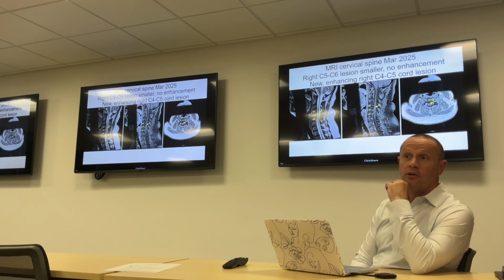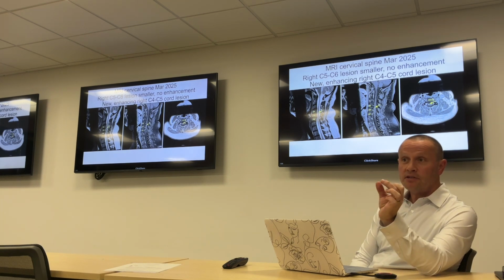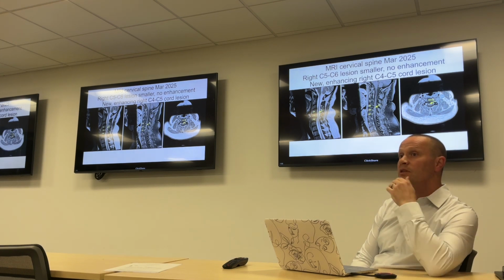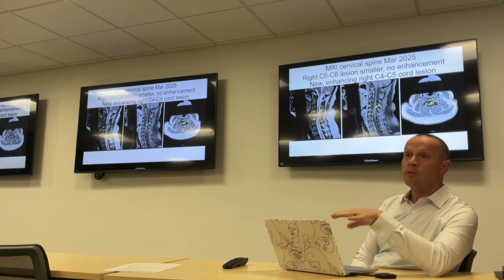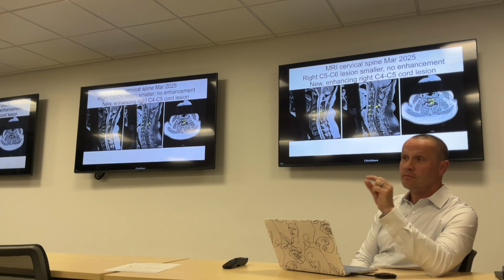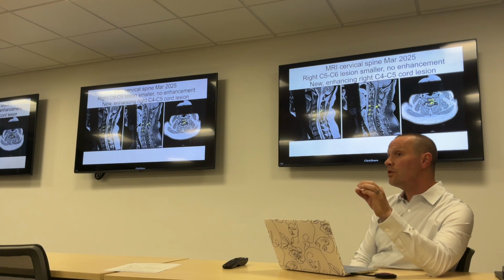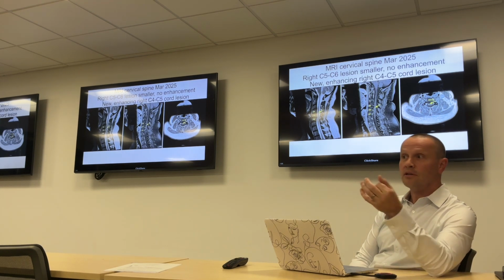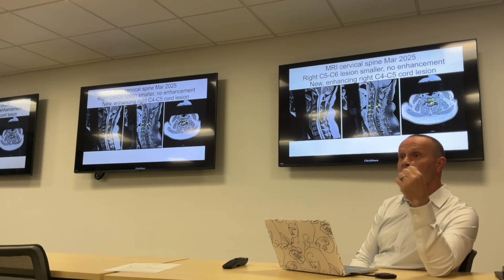That's a good question, and I don't know the answer if I'm being honest. MS lesions vary in size. If there's an area of demyelination that is small enough, it might not even show up on our MRI, or it might be between slices. We don't get a perfect picture of the brain, enough to see every cell. So if there's a small lesion that is in between slices or just too small for the detection limits of our machine, that could explain it.